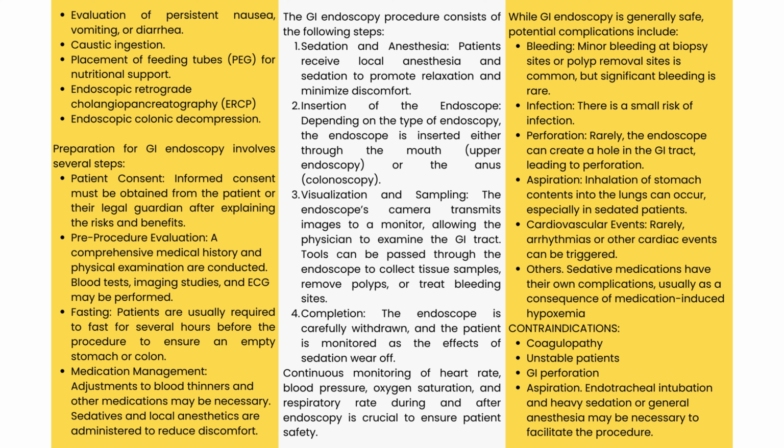The endoscope's camera transmits images to a monitor, allowing the physician to examine the GI tract. Tools can be passed through the endoscope to collect tissue samples, remove polyps, or treat bleeding sites. Completion: the endoscope is carefully withdrawn. Continuous monitoring is performed to ensure patient safety.